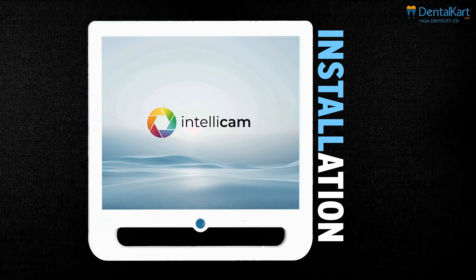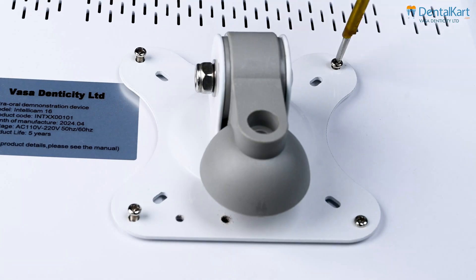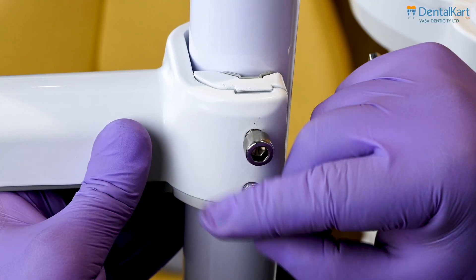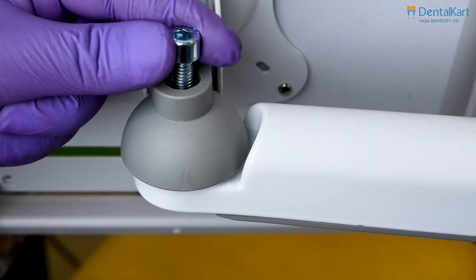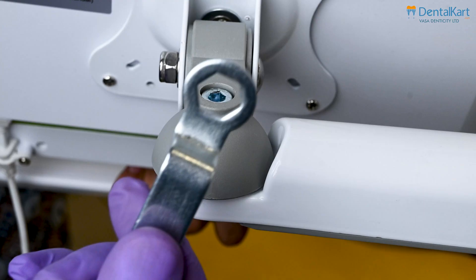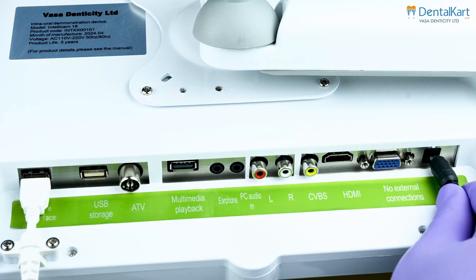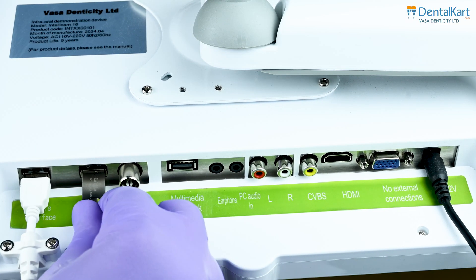Coming on to the installation process. Install the monitor on the stand through the four screws on the back. Connect the extension arm with the dental unit, then connect the monitor screen to the extension arm. Plug in the power adapter and connect the power supply. Connect the pen drive to the USB storage slot.